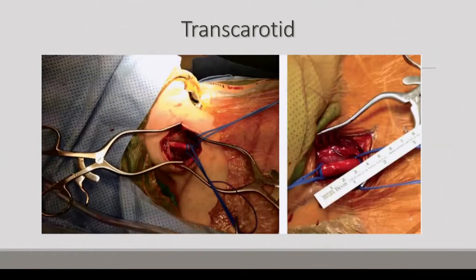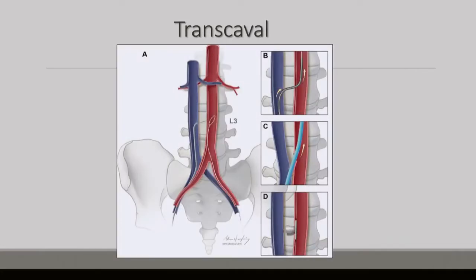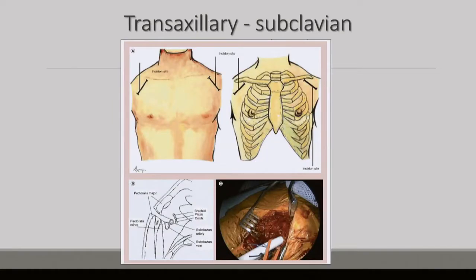The transcarotid approach is a very feasible approach. Surgeons are very used to exposing carotids. However, the higher stroke rate compared to transfemoral or other non-femoral sites is a concern. Transcaval, described lately in 2013, goes from the femoral vein, puncturing the infrarenal portion of the IVC to the aorta, and closing this defect with a device later on. It is also an option, but it requires a lot of expertise and experience.